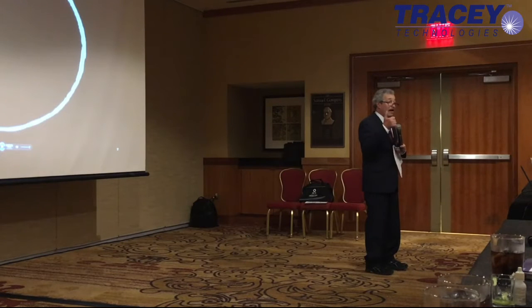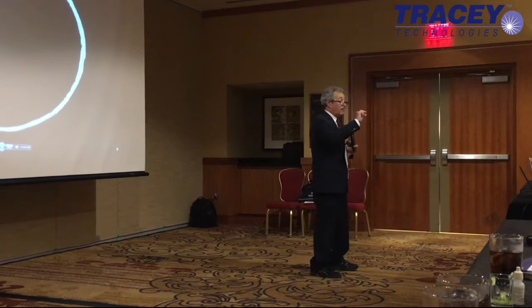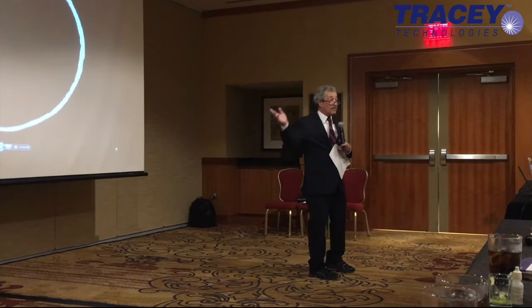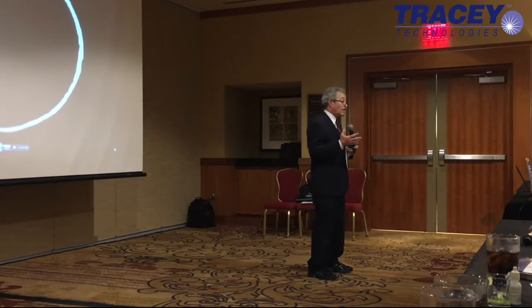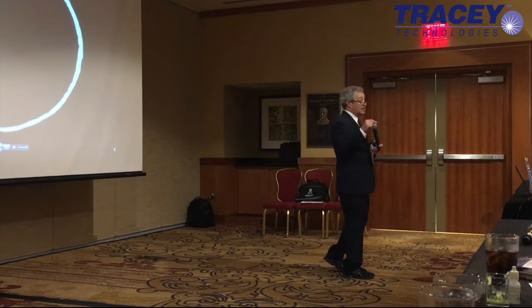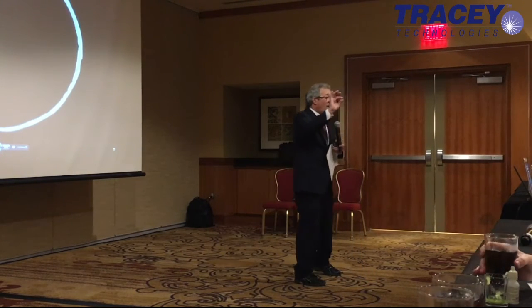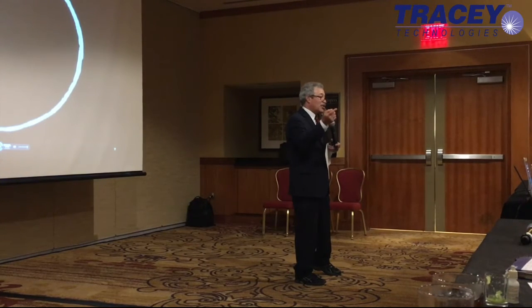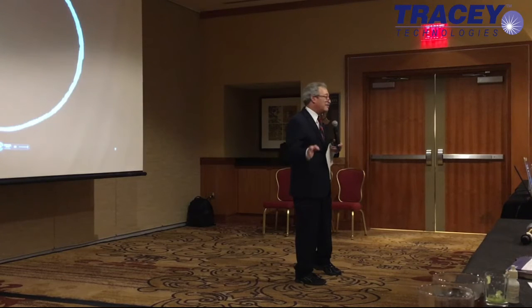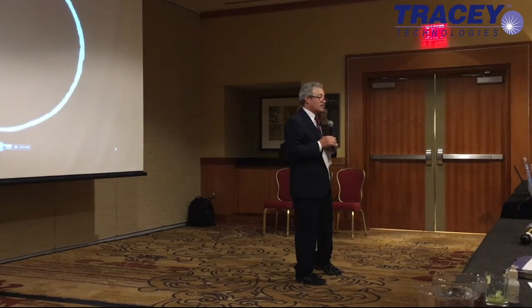To begin with, I love to look at the aberrations. And I show the patient, when they have one long bar on their astigmatism on the cornea side, I say, this is your astigmatism, this is what we're going to correct with a toric lens. When they have one long bar on the intraocular side in the lens, I say, I know you were referred for a toric lens, but you don't need one. So you see this one bar? This is inside the eye. It's going to be gone after surgery.